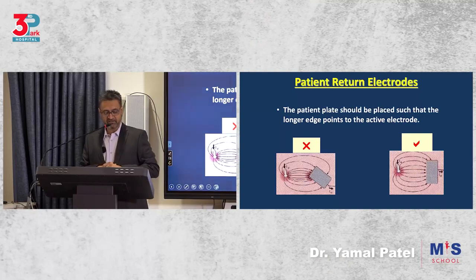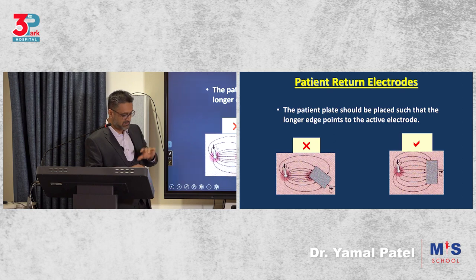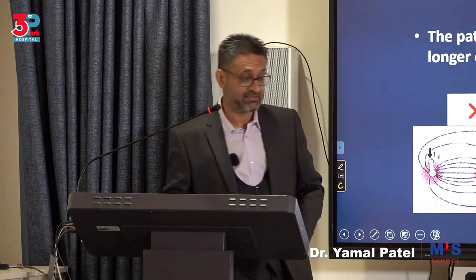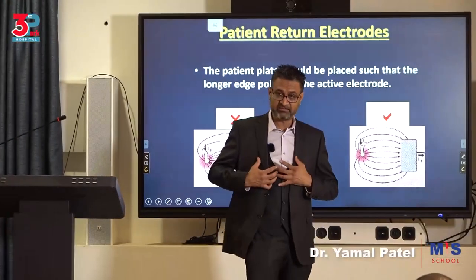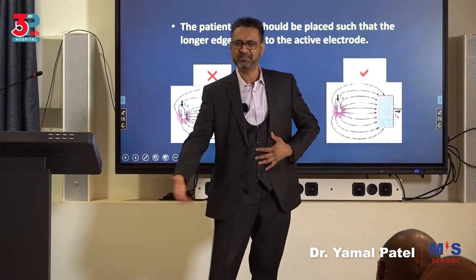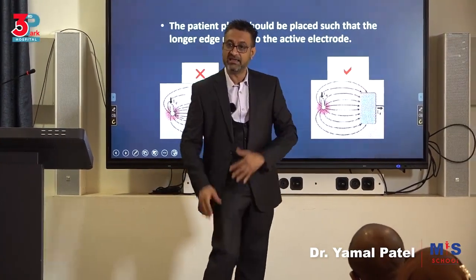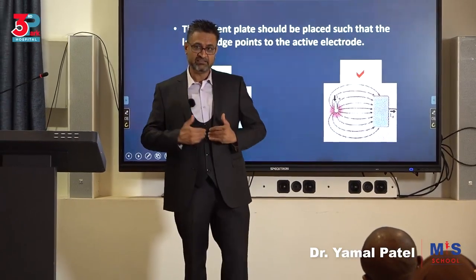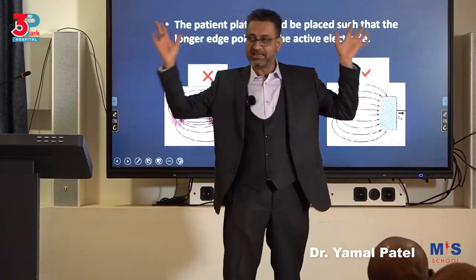Now, the return electrode rules. They should always be placed across the patient. I always tell people the return electrode should be closest to the surgical site. So you don't operate here and put it there; that's a bit far. Put it close to the surgical site, under the buttocks or on the thigh would be best. The reason is you don't want stray current to find its way from here to there. It's pretty far, so it looks for exits.